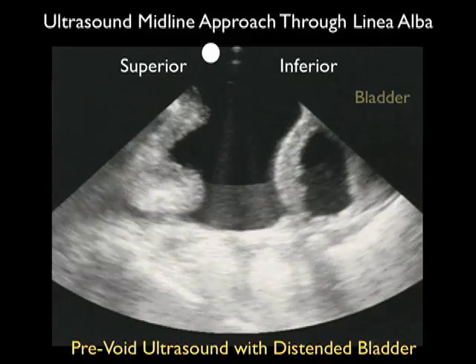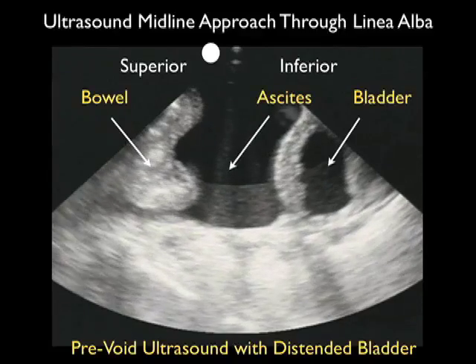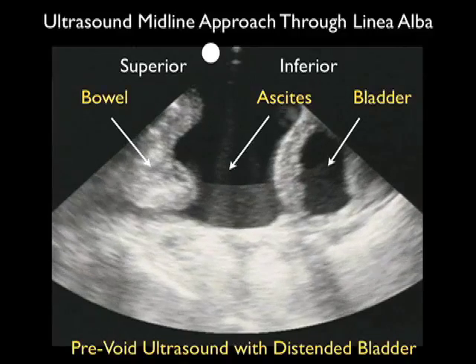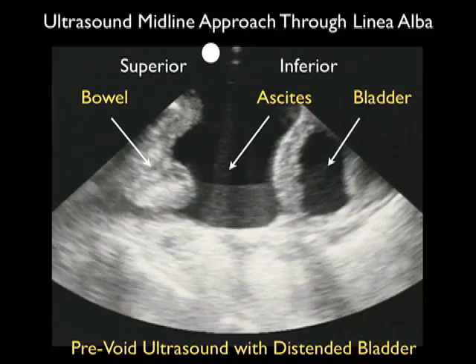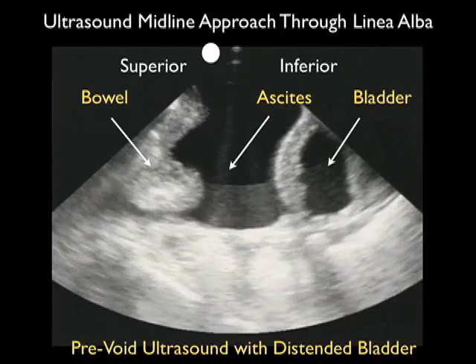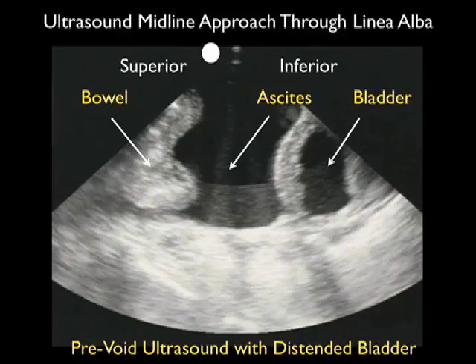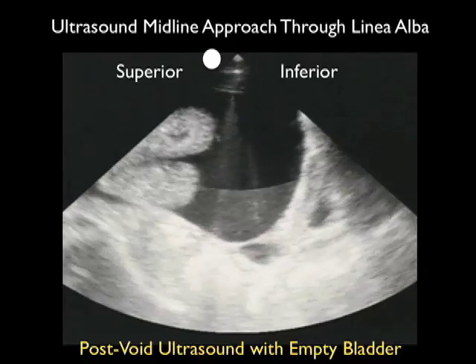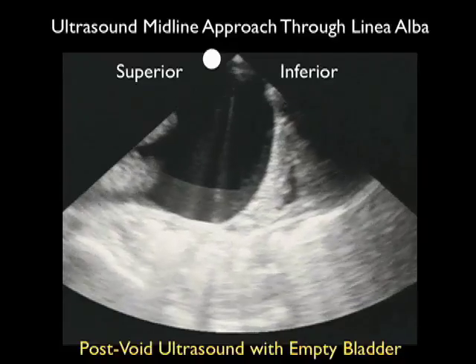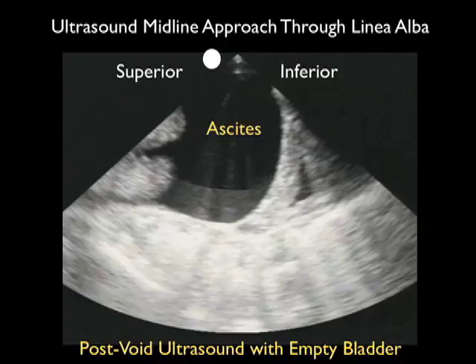Here's a video clip from the midline linea alba taken with a 3 megahertz probe, oriented with superior towards the left and inferior towards the right. We see bowels superiorly moving up and down within the ascites fluid in the middle of the image, and the bladder — relatively large — towards the inferior aspect. To increase safety from the midline linea alba approach, we'd want to drain the bladder prior to puncture. Here's a clip from the same patient after having him completely void. Now we have the decompressed bladder making the ascites pocket much larger and more amenable to paracentesis, with the pocket of ascites visible as the dark anechoic fluid collection between the bowel superiorly and the decompressed bladder inferiorly.